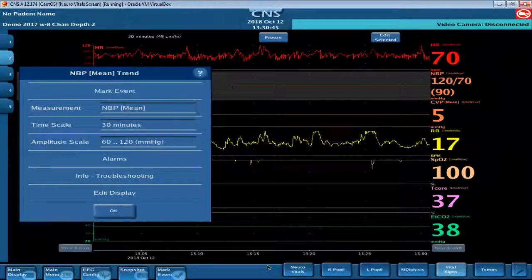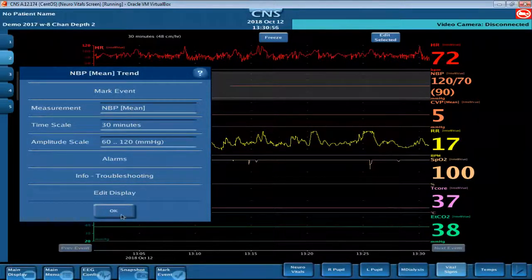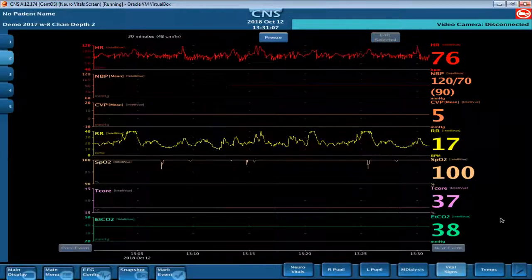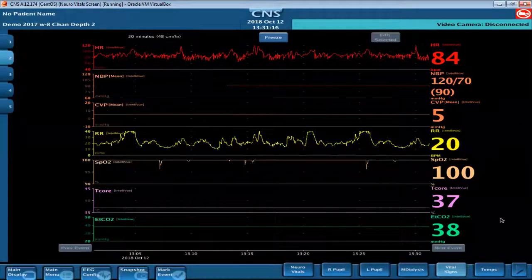I don't know, Kathy, and you can guide me if we want to get into this today, if we want to just leave some more time for questions. But the other thing to talk about is if you want to add a parameter to a screen and the parameters are sort of all used up, and that would be getting more into editing protocols in general. Maybe we can show that specific aspect of changing protocols and then do a more comprehensive review of protocol next time we meet up. Okay, that sounds great.